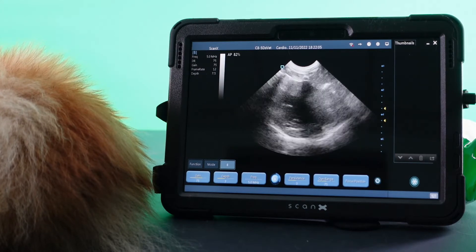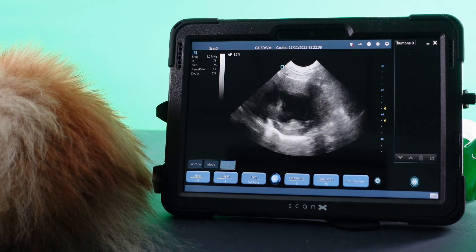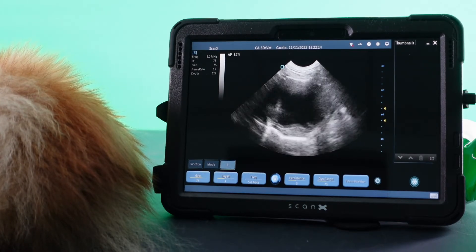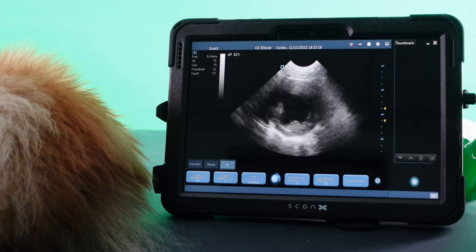With a 90-degree twist I can get to the short axis. I'm at papillary muscle level here and I can just watch all the walls squeezing into the cavity. It looks like her systolic function is normal.